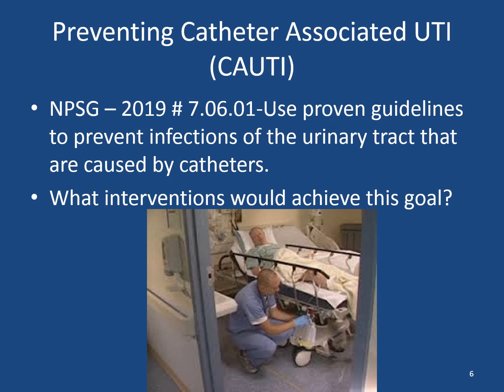Make sure that we are using aseptic technique, and many institutions provide prepackaged wipes. So if you are at your clinical site, make sure you look for those. A lot of times it even walks you through how the package expects you to use the wipes, similar to the bath in a bag. So again, we want to change the catheter only when necessary.